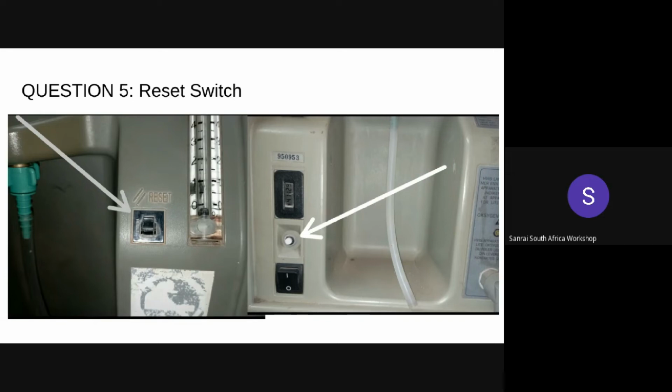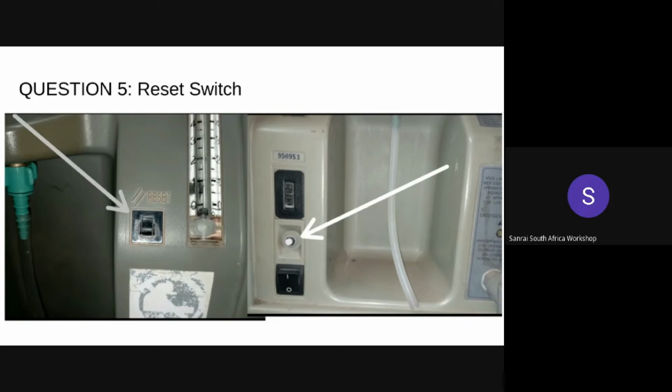As once explained in the topic of interest a couple of weeks back, voltage sags are a reduction in voltage in the mains, which lasts longer than 10 milliseconds. These are caused by a large number of electrical loads being switched on and thereby overloading the grid. During a voltage sag, the motor might stop running. Sometimes the motor may not completely stop running due to low voltages. In such circumstances, the motor is forced to overwork to make up for the lower voltage, thereby drawing more current and causing the reset switch of the concentrator to trip.